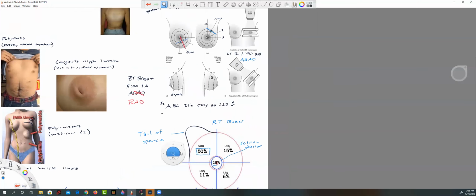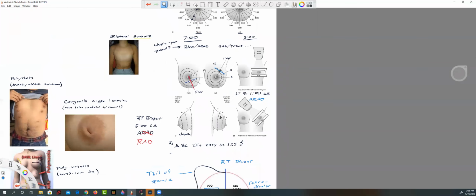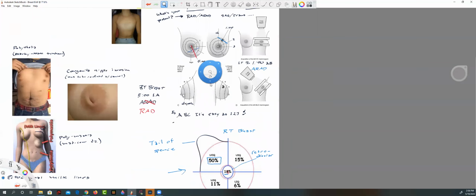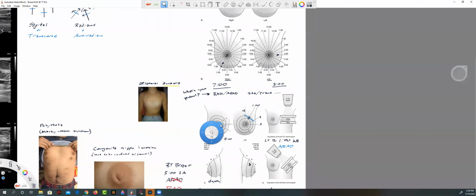In all of these, whether your location just does quadrants, whether they do ABC 1, 2, 3, and if they don't use ABC 1, 2, 3, you know what, I'll tell you about the alternative to ABC 1, 2, 3, but no matter what you're doing, you also have this region.